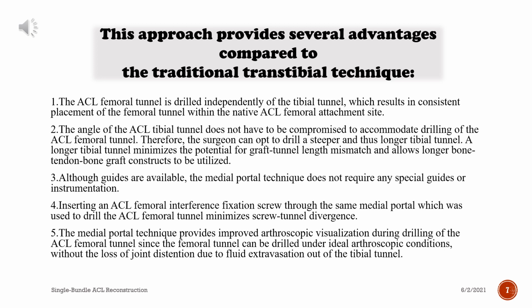A longer tibial tunnel minimizes the potential for graft tunnel length mismatch and allows longer bone-tendon bone graft constructs to be utilized. Although guides are available, the medial portal technique does not require any special guides or instrumentation. Inserting an ACL femoral interference fixation screw through the same medial portal which was used to drill the ACL femoral tunnel minimizes screw tunnel divergence.